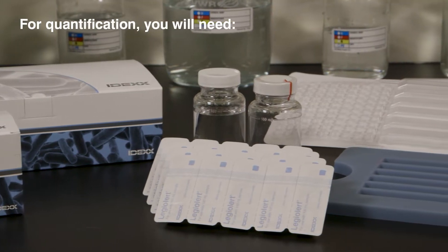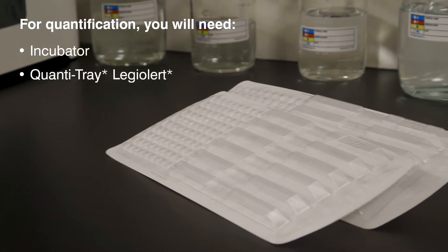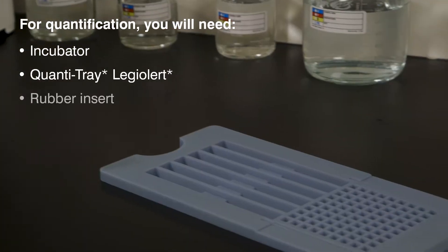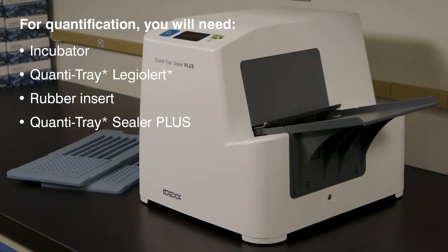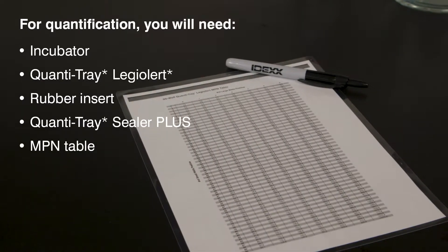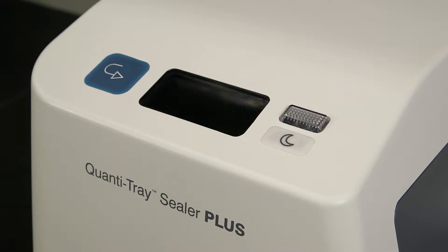For quantification, you will need an incubator, a Quantitray LEGALERT rubber insert, a Quantitray sealer plus, and the included most probable number table or the IDEX automated MPN generator program found at IDEX.com. Turn on the sealer and then wait until a green bar appears on the display. The sealer has now reached the appropriate sealing temperature.